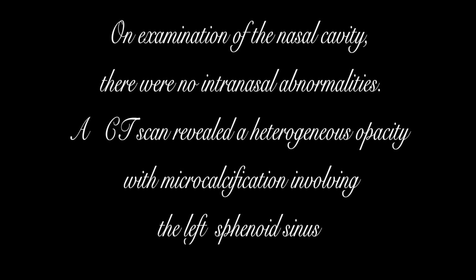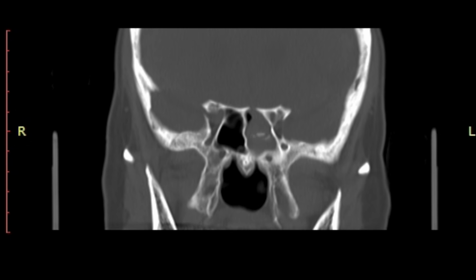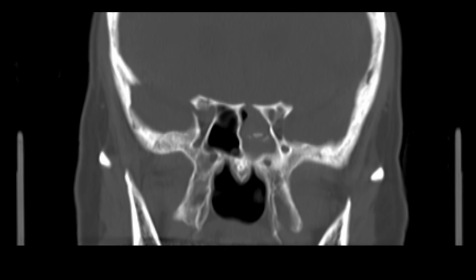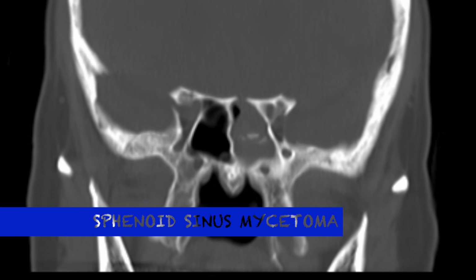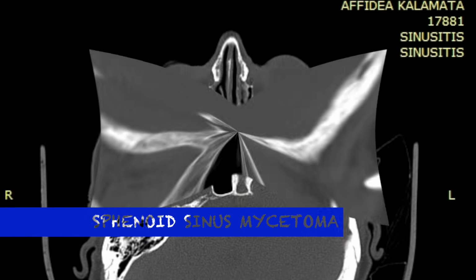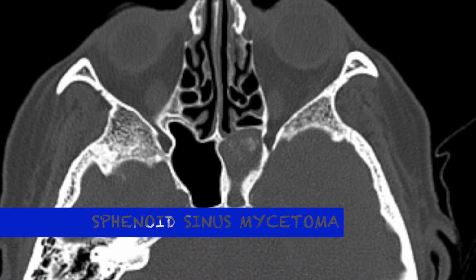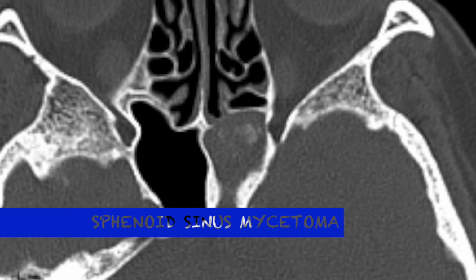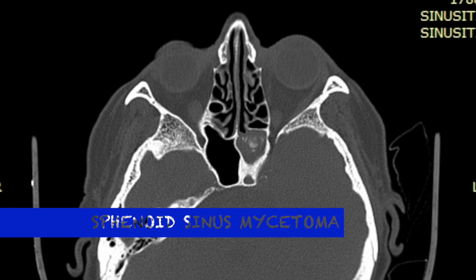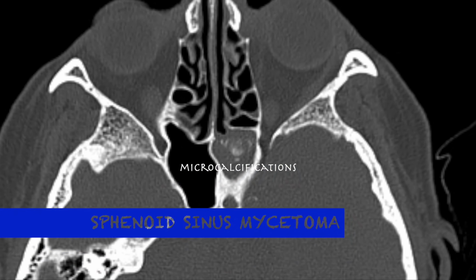A CT scan revealed a heterogeneous opacity with microcalcification involving the left sphenoid sinus. Microcalcifications.